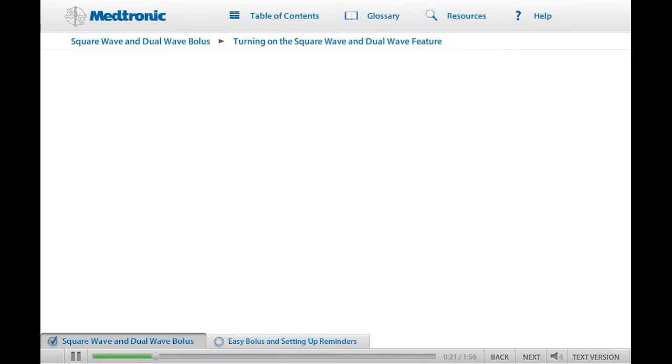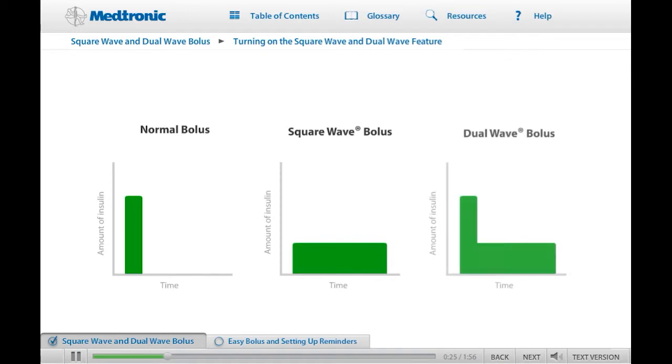Remember that there are three types of bolus: normal, square wave, and dual wave. Up to this point, you have delivered only normal boluses. Let's discuss square and dual wave boluses now.